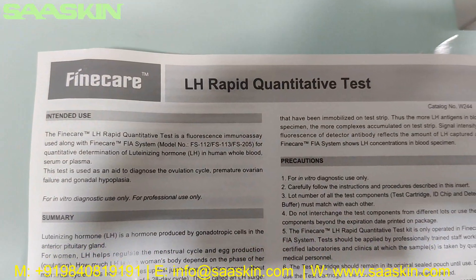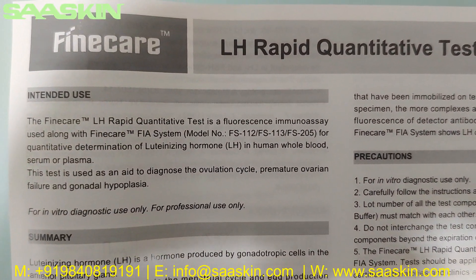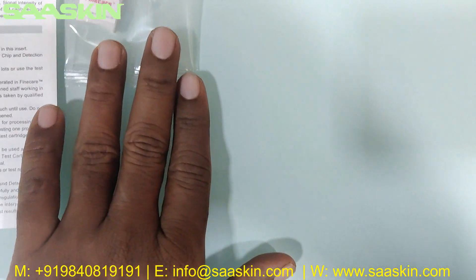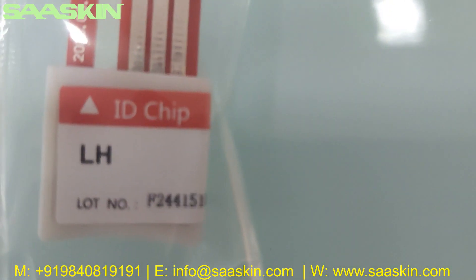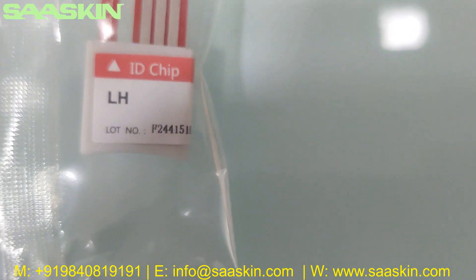The leaflet confirms this is the LH Rapid quantitative test, which can be run with the FIA instrument. Inside, you can also see there is one ID chip, which contains information about the test type and the lot number.